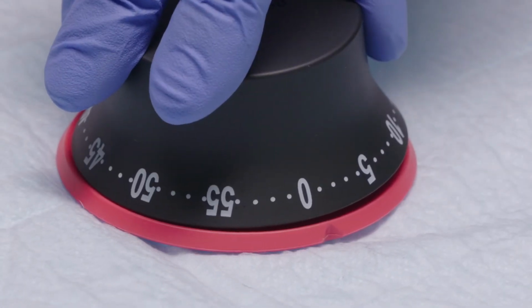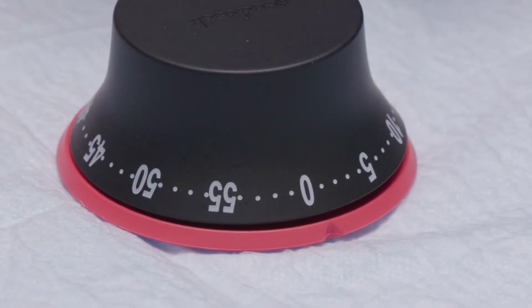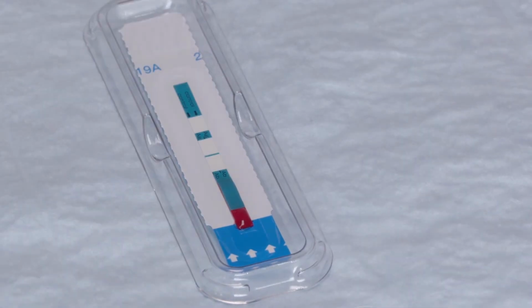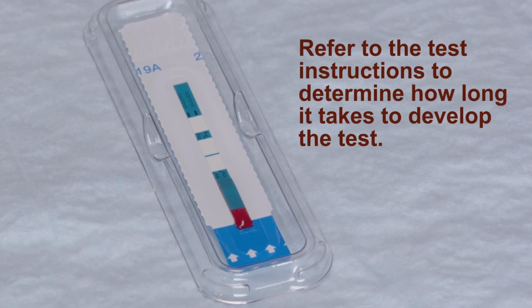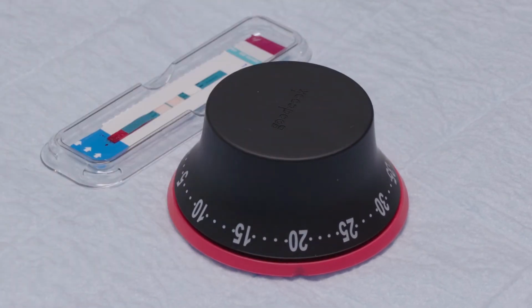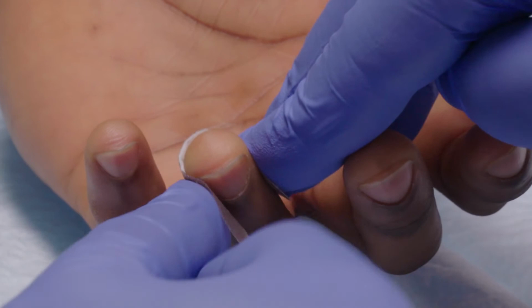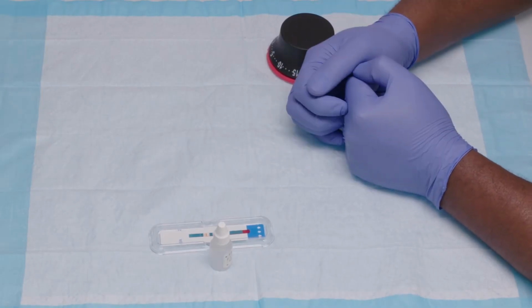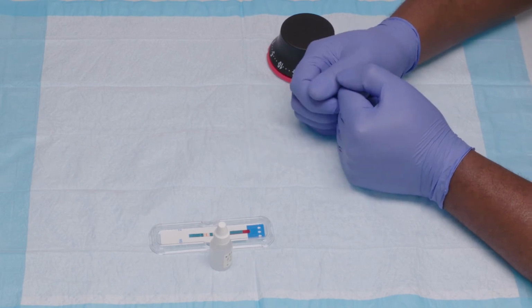After you place the blood in the sample area, set the timer to 1 minute. Once the timer beeps, add 1 drop of chase buffer. Refer to the test instructions to determine how long it takes to develop the test. For this test, set the timer for 20 minutes. Now, you have time to bandage your client's finger. Read the results between 20 to 30 minutes after you've added the chase buffer.